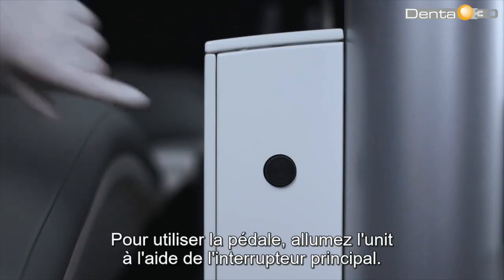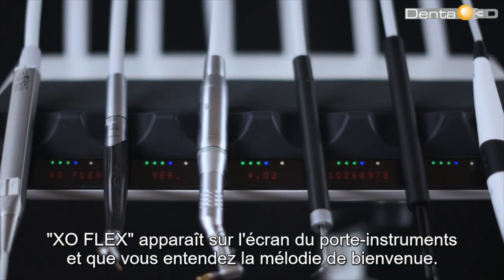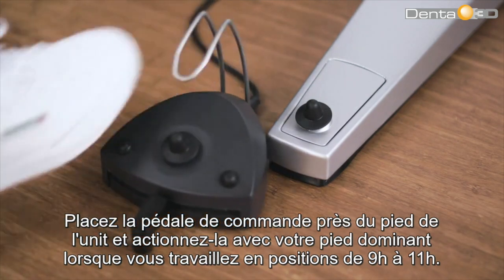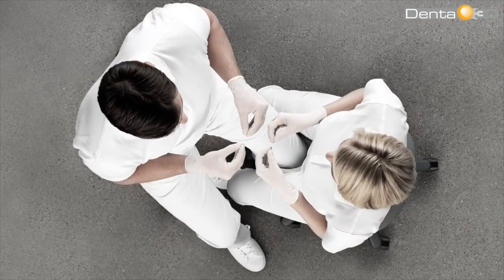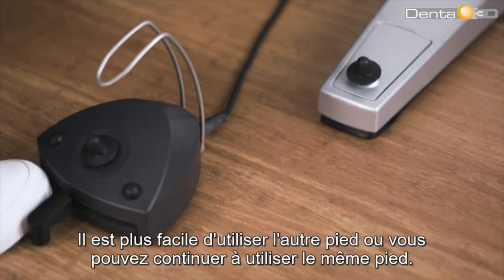To operate with the foot control, switch the unit on using the main switch. The unit is ready for use after a few seconds when the text XO Flex is shown on the instrument bridge display and you hear the welcome tune. Place the foot control close to the unit's supporting leg and operate it with your dominant foot when working in position 9 to 11 o'clock. In working position 12 o'clock, you may find it easier to adjust the position of the foot control.